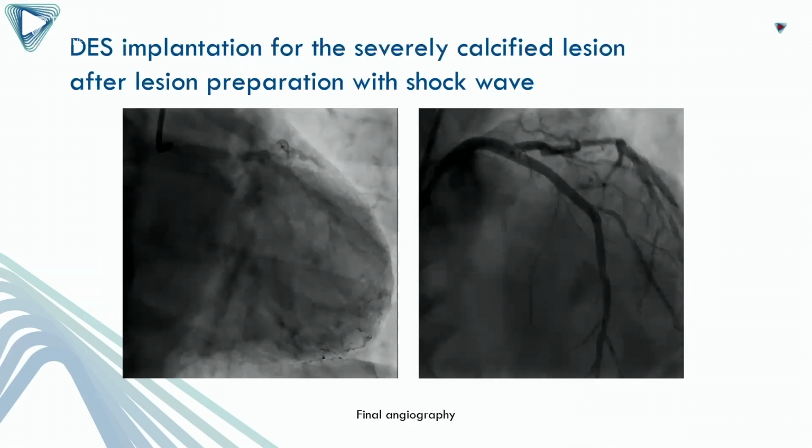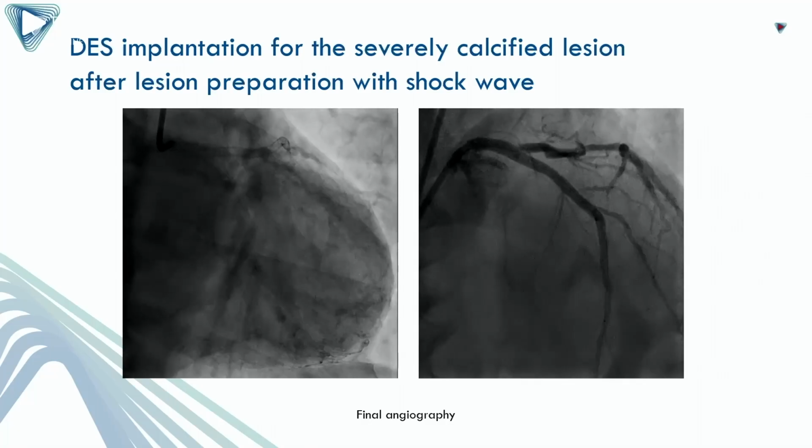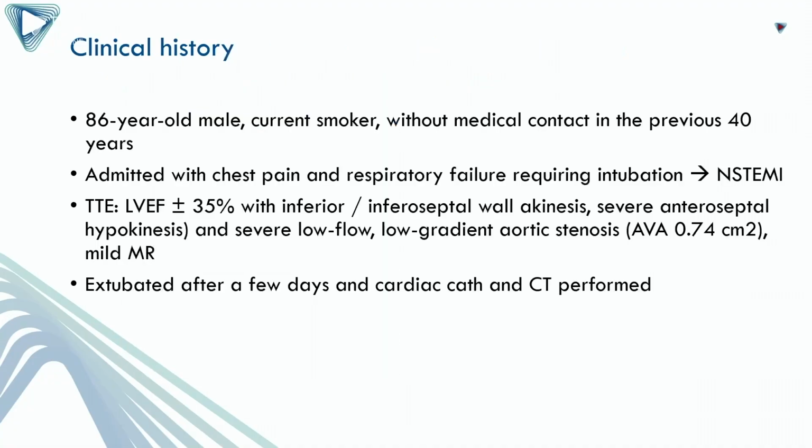Here's the final angiography, really showing you a great result in a very complex left main LAD lesion. So briefly, in the little time I have left, I want to show you another quick case, just to show you the versatility of this device.